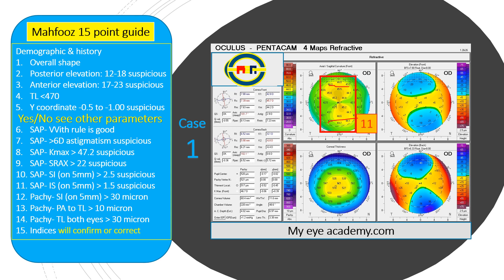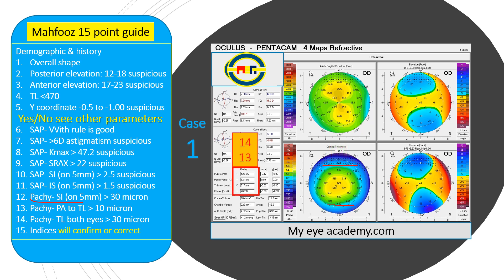Number eleven: the inferior-superior difference is less than 1.5 — again normal. Number twelve: looking at the pachymetry at the superior and inferior five millimeter ring, the difference is less than 30 microns, so that's again a good sign. Number thirteen: the pachymetry at the pachy apex and thinnest location — the difference is less than 10 microns, so that's again normal.